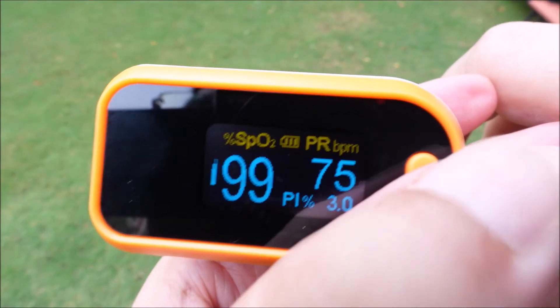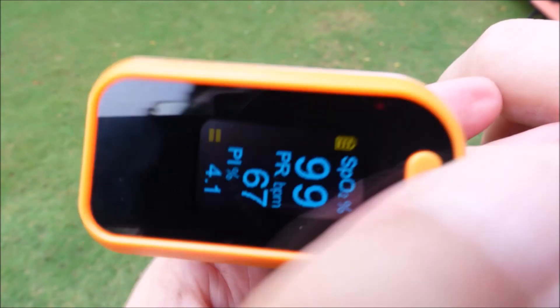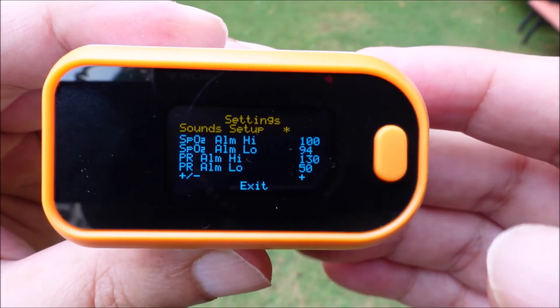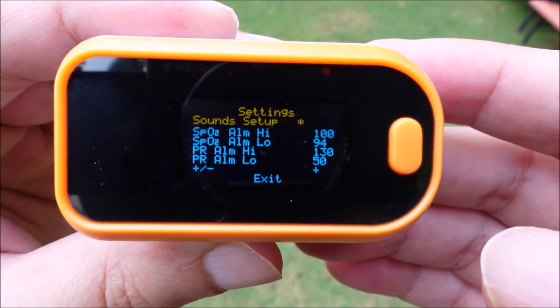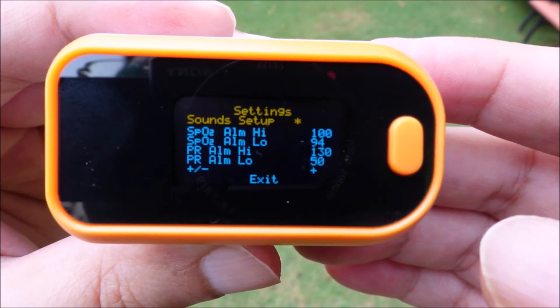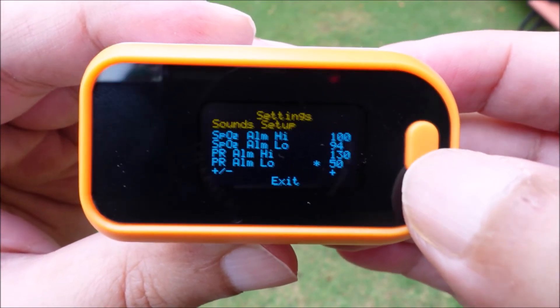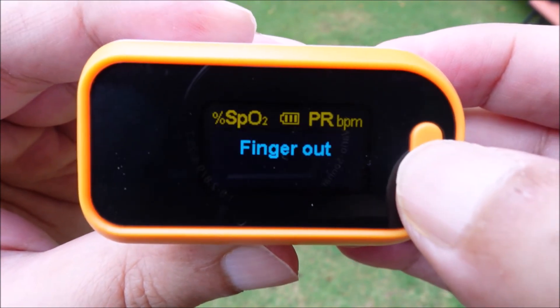If you press the button again and again, you see the readings in different screen orientations. Pressing the button for 3 seconds will take you to the settings menu. To change any option you have to press the button for 3 seconds. We recommend not to change any settings.